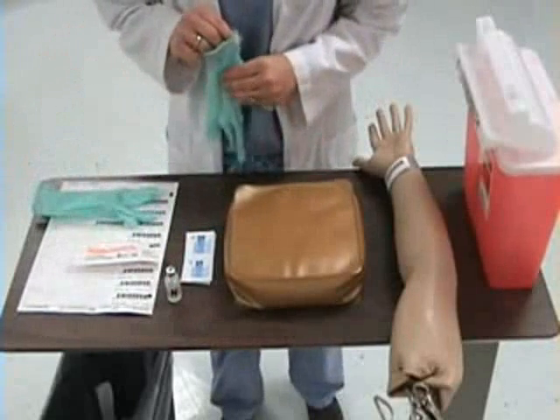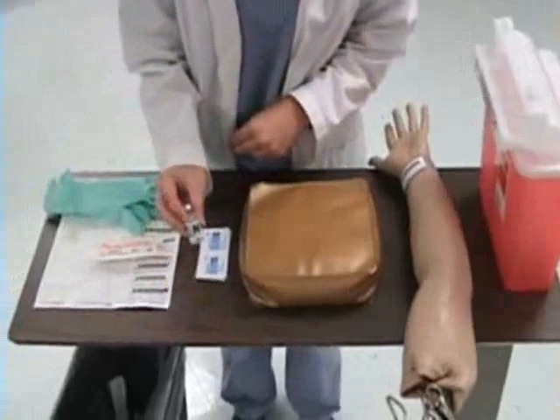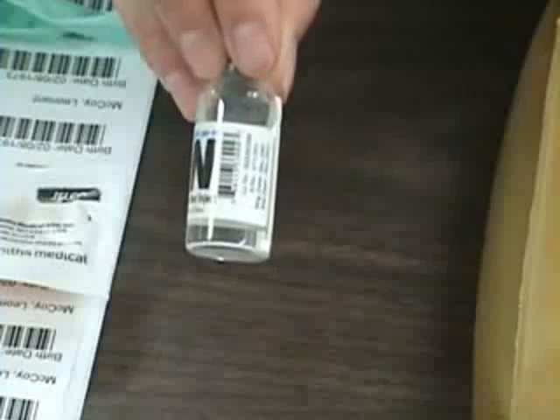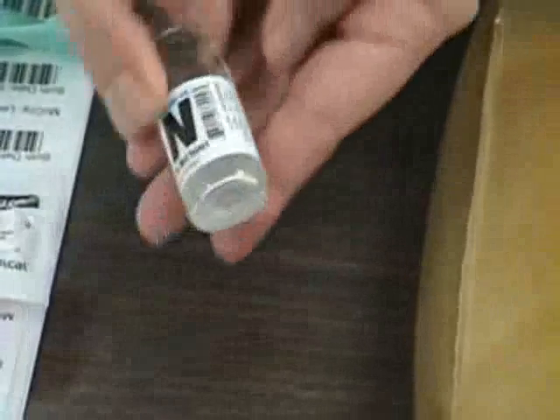I will begin by drawing up my medication. Today I will be giving NPH insulin. NPH insulin has a precipitate in it and must be rolled to reconstitute the medication before withdrawing it out of the syringe. I will gently roll it between my hands to reconstitute the medication. I should not shake the vial to reconstitute the medication.